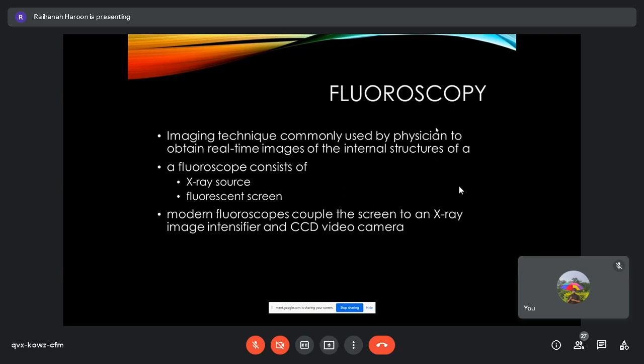That's why, for example, when you do a barium swallow, you give the patient a drink of barium. We want to see how the contrast flows as the patient keeps the contrast inside the mouth and starts to swallow until everything goes into the stomach. We want to see the movement of the esophagus, for example. Okay, and that's the second difference.